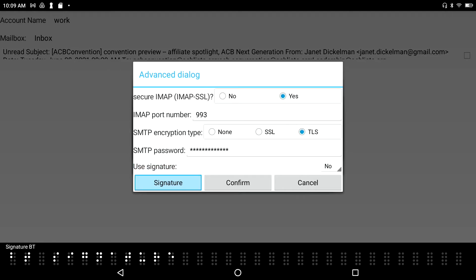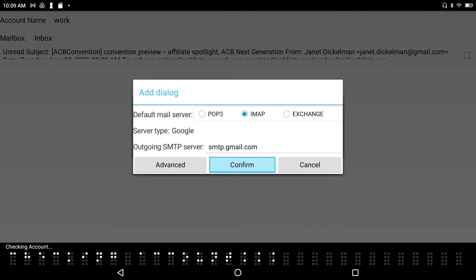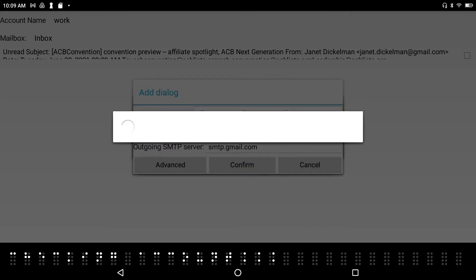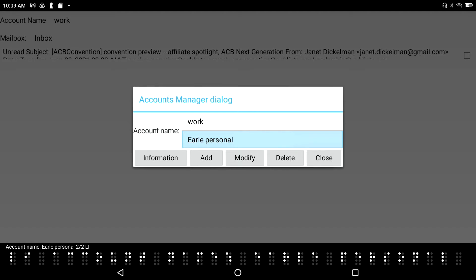I tab past the Signature button to the Confirm button and press Enter. That exits the Advanced panel, and another Confirm button appears. I press Enter again, and the account is successfully added.